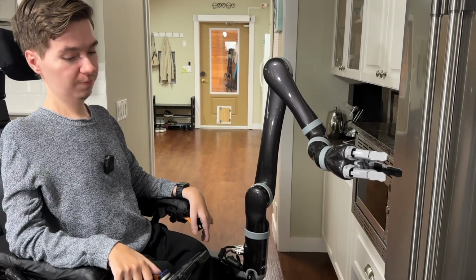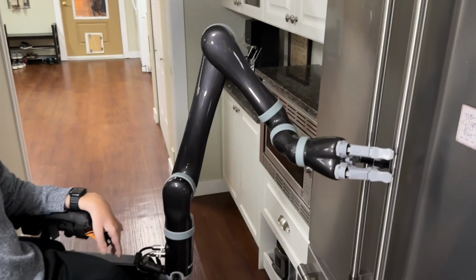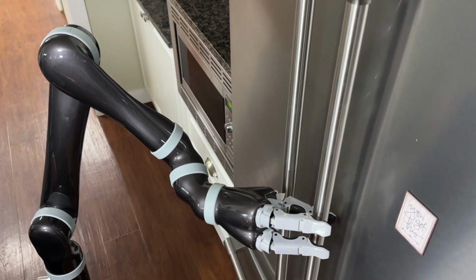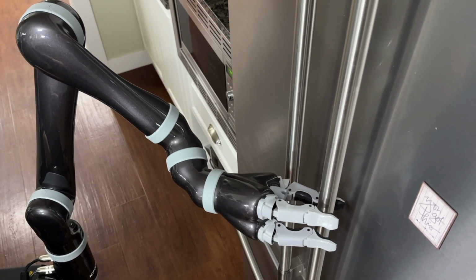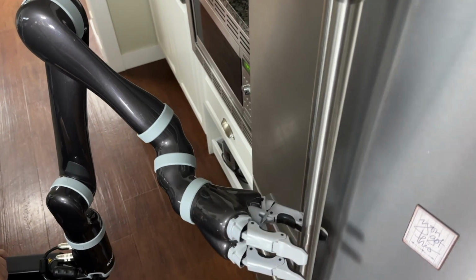So what we're going to do is bring Jaco's hand in and hook the thumb just behind this door handle. And as we're doing this whole thing, we want to be careful that we're not stressing Jaco's fingers too much. If you think about a human hand, it hurts when the finger is bent backwards too far. Well, the same can be said about Jaco.